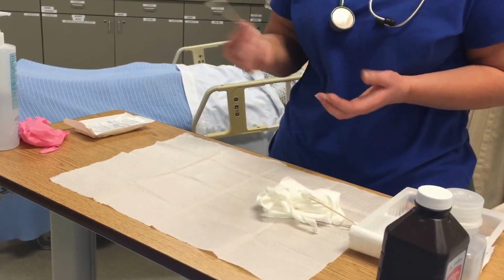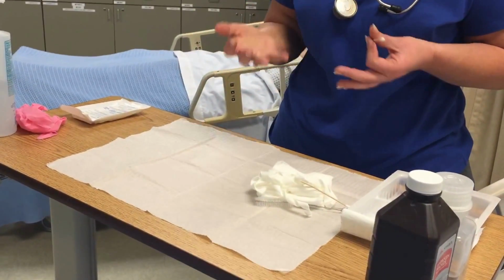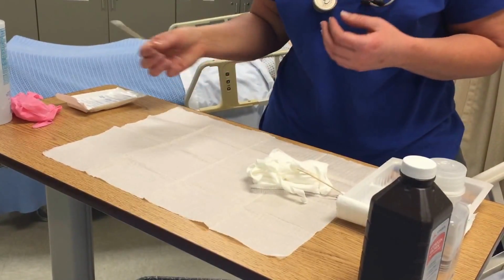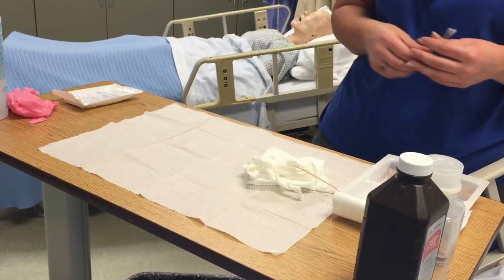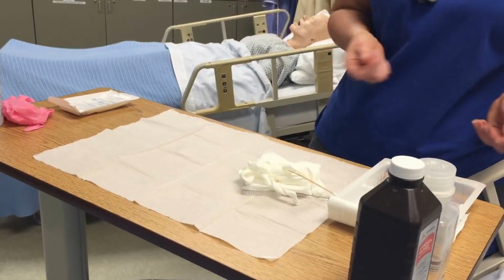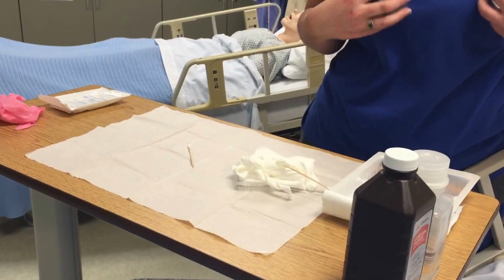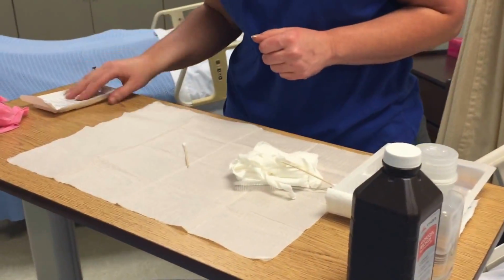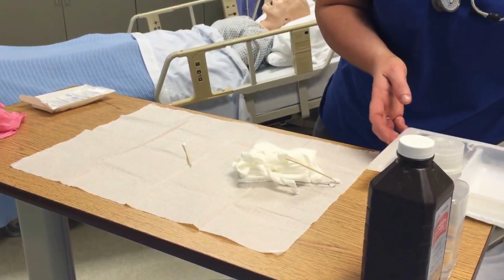For some reason, if you should have something that would fall out separate, then just get a new one that was in a sterile pack or whatever and put that on there. So this one that came off, that's fine. I would just get a new one. So we'll have the tech bring me a new one. And so she brings in a new sterile one. So I open that one up, and that one just gets plopped on there. All right. So, great. Okay. So what we're going to do is set this up.